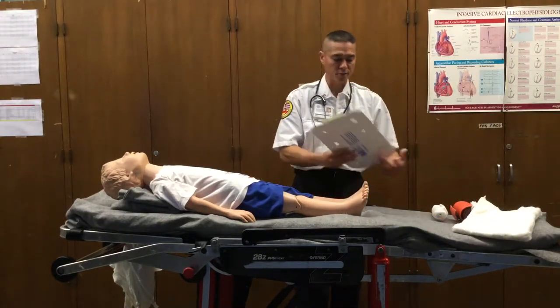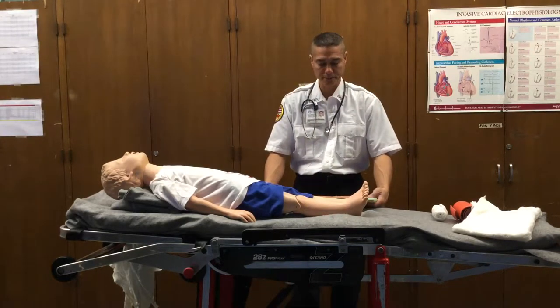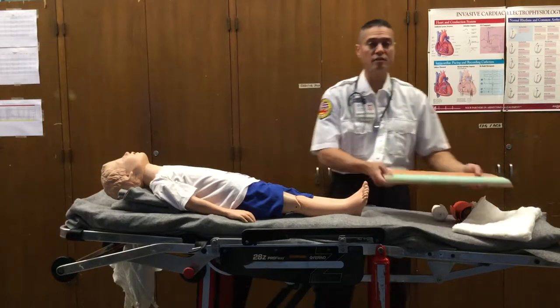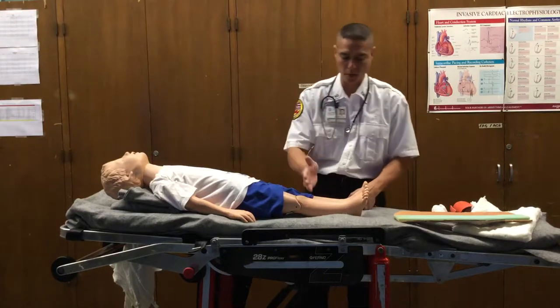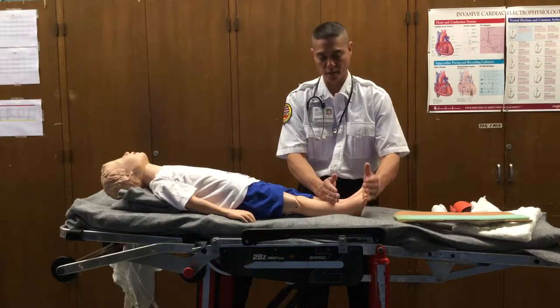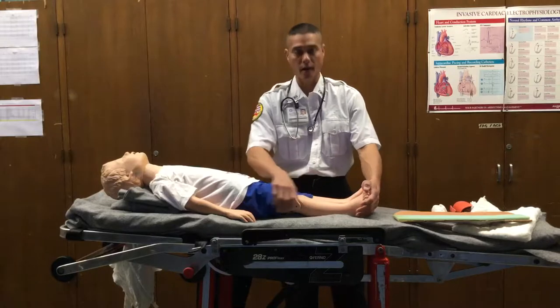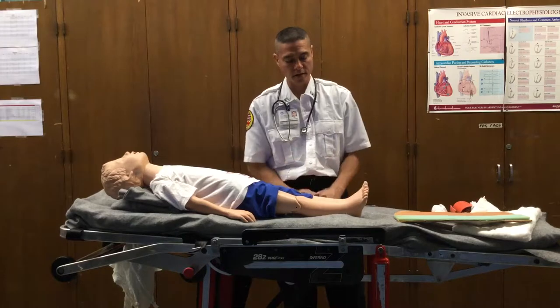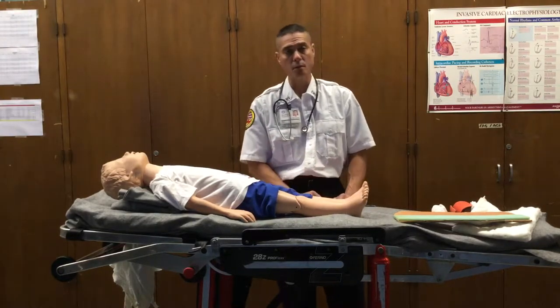As far as splinting goes, you're going to take your splint and measure on the unaffected side so that you immobilize the joints above and below the fractured or injured side. As an example, if the injury is somewhere down at the ankle area, we want to secure the foot, the ankle, and potentially up to the knee — all covered by our splint so that it's covering the joints above and below the injured side and keeping it immobilized.